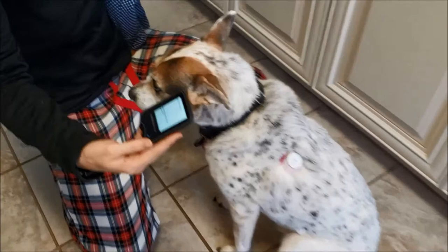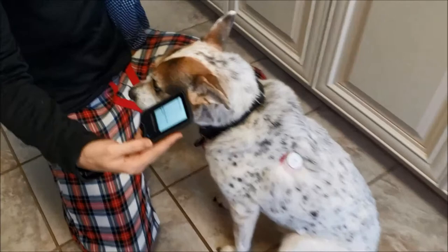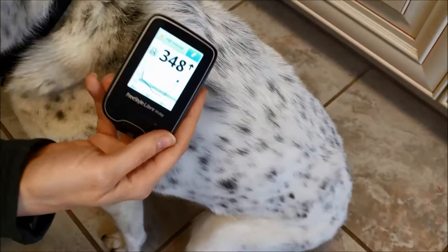I'm gonna hit this blue button here on the reader. Then it has this screen and we're gonna wave it over there. We've got our reading. Look how easy that was.